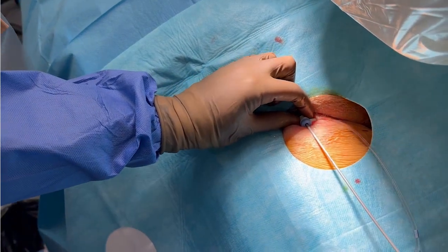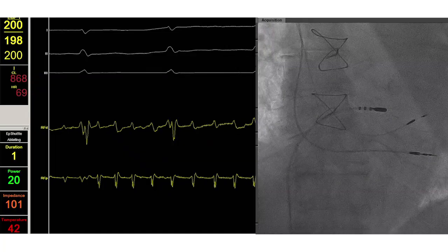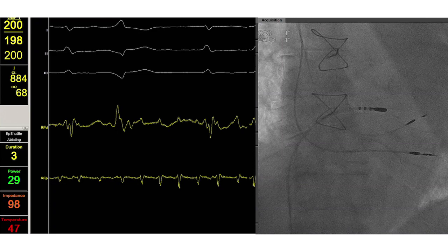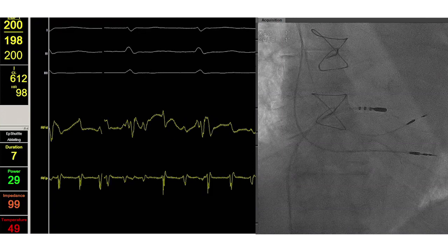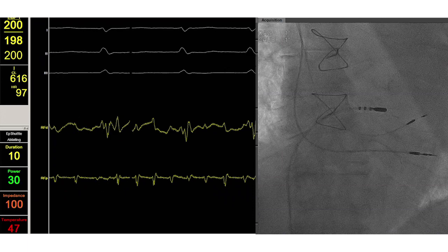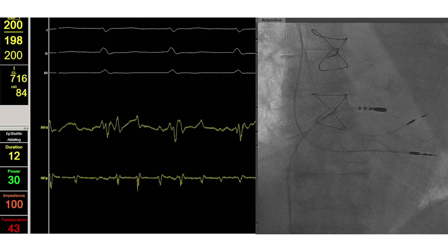The top yellow signal, distal electrode, shows a nice combination of atrial and ventricular signals. Observe also how the ablation catheter reaches over the tricuspid valve towards the sweet spot for ablation.